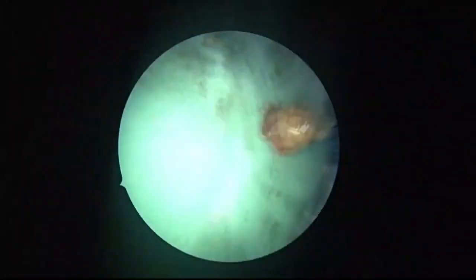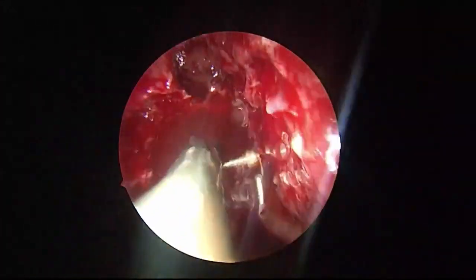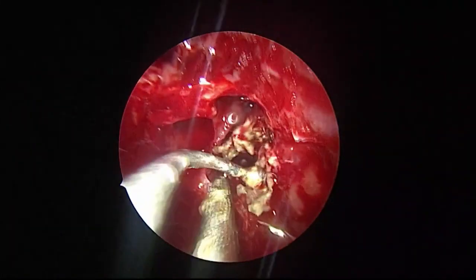Again, a big chunk comes out. Same exercise everywhere.